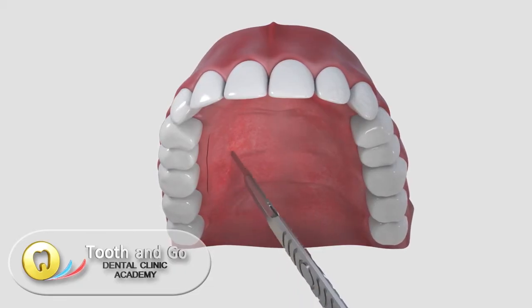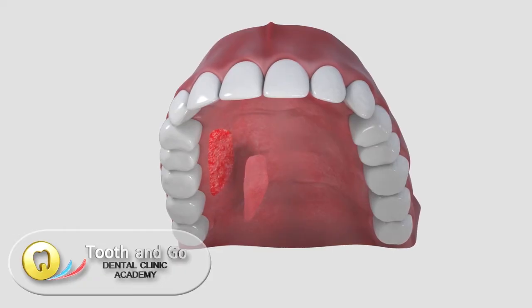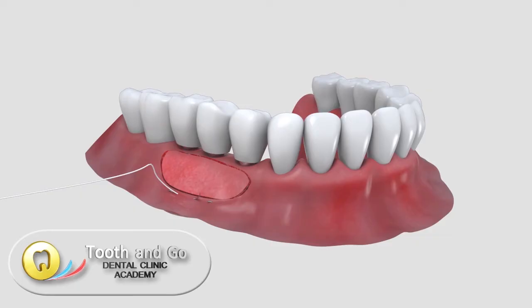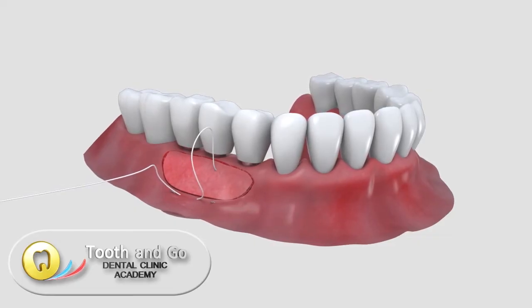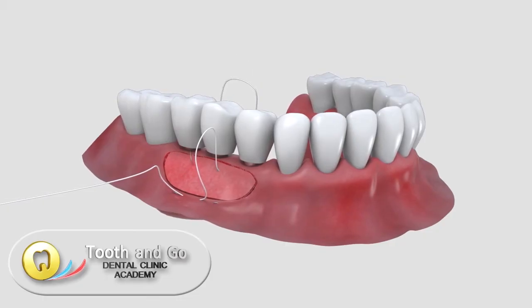Rigid gingiva will be harvested from the palate and transplanted to the area where the mobile tissue was removed. Stable stitches will prevent any mobility of the harvested gums and guarantee unproblematic healing.